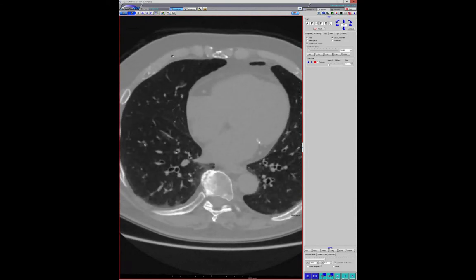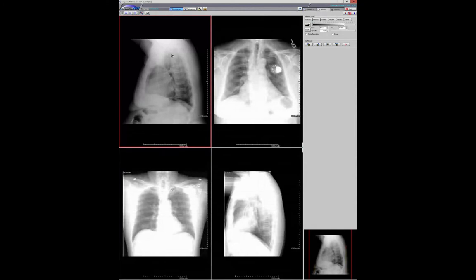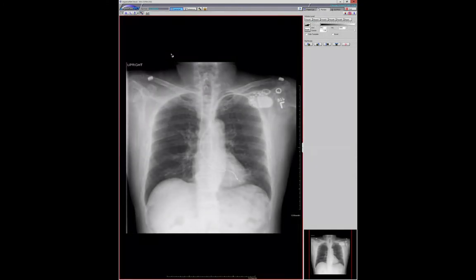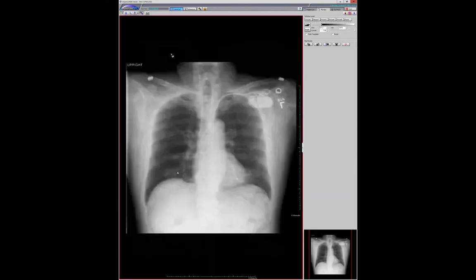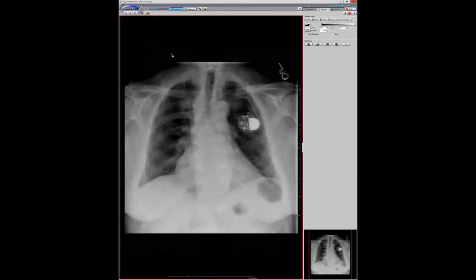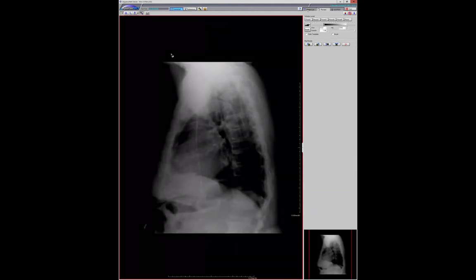And then this is just, I had to show this for the iatrogeny segment. These are two cases. Here's one pacer that somehow on the outside got put into a funky place. You can see that, although this could theoretically be fooled for a right ventricle placement, the posterior directed one into the most posterior chamber would be very concerning, as well as the anterior placement. And then here's another one that we just got a CT on showing a nice placement into the aorta and on the lateral. And then here are the associated CTs.